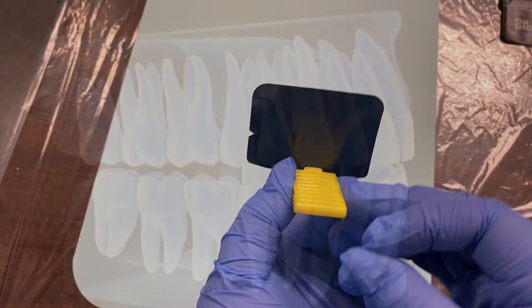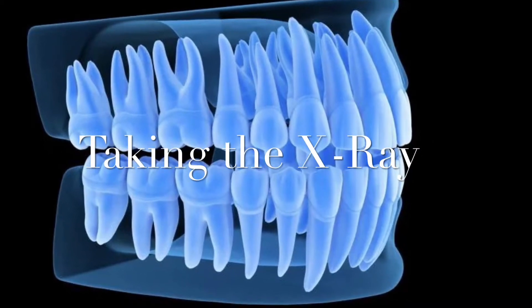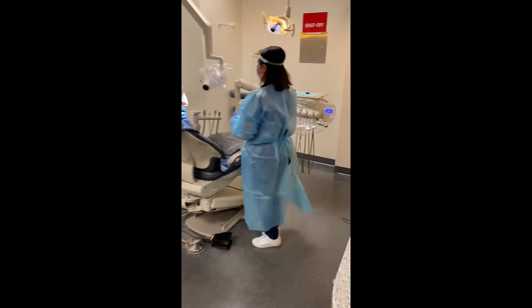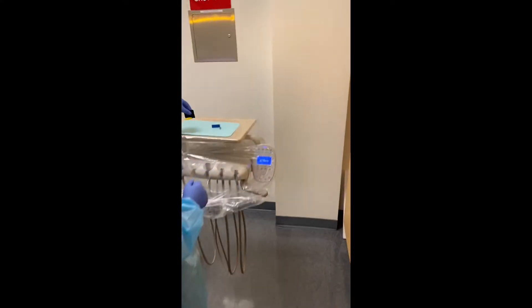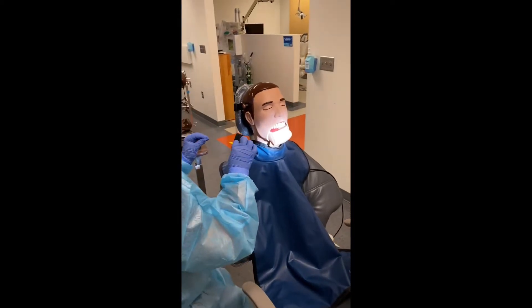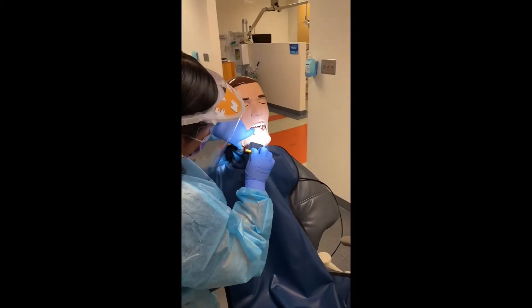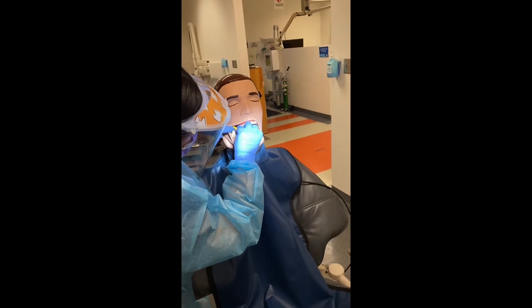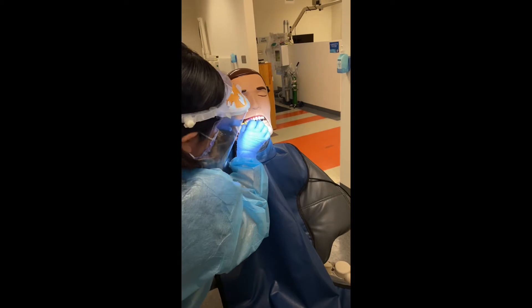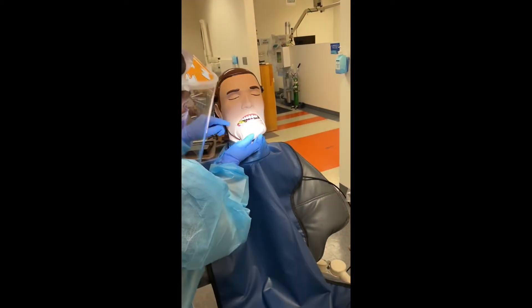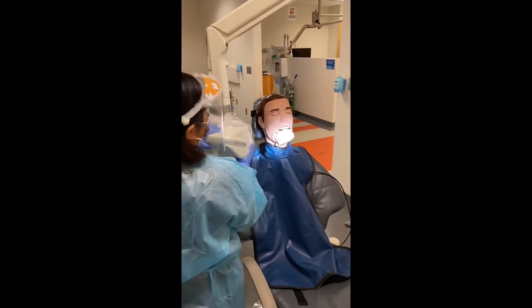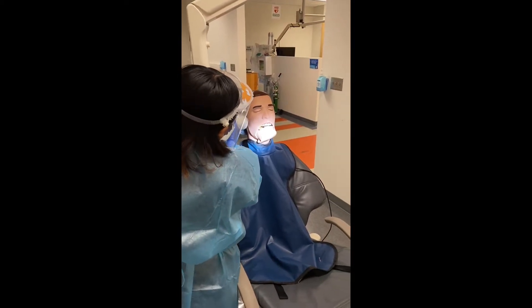And now we're ready to take the x-ray. Moving on to taking the x-ray on our patient Dexter, I'll be grabbing the built-in bite block that we already built and I'll be placing it in the designated area that we need the radiograph on. For here, we'll be doing a posterior PA on the upper right-hand quadrant and we want to make sure since we're doing posterior teeth, if the patient has a third molar, we get that third molar all the way in the back and make sure that we get the apex as well.